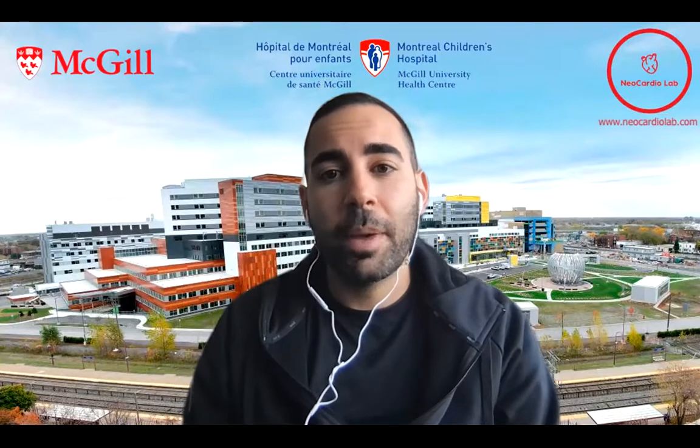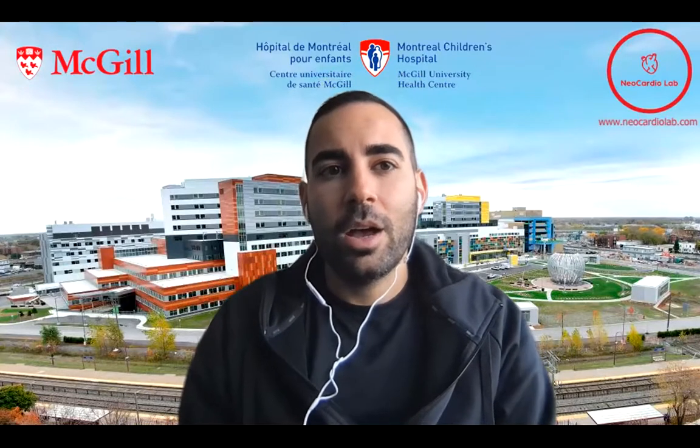Hello, everyone. Welcome to this video workshop that is being done for educational purposes on targeted neonatal echocardiography and neonatal echocardiography. This workshop will specifically address the parasternal short axis view that we can do in the context of a neonatal echocardiography. And really, these information capsules are done for educational purposes.